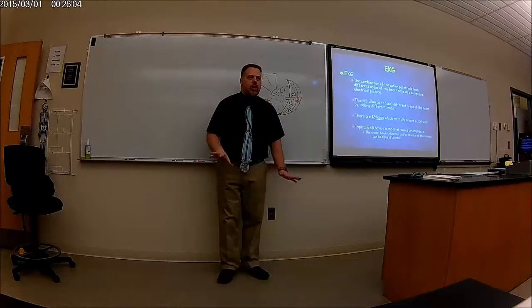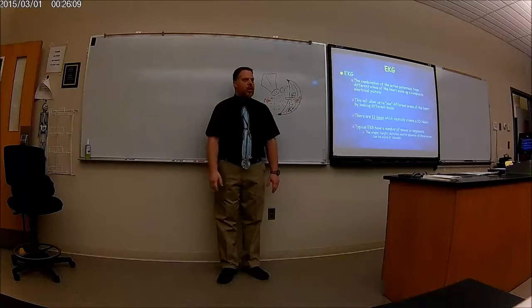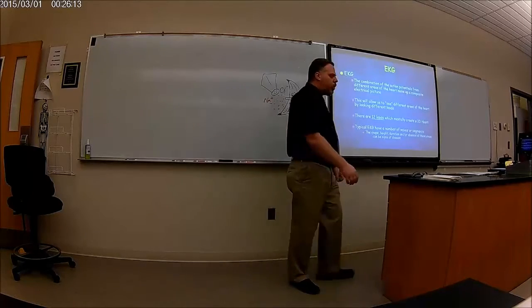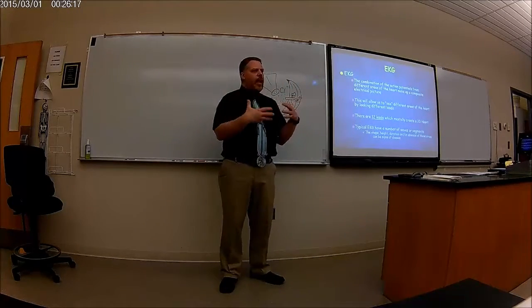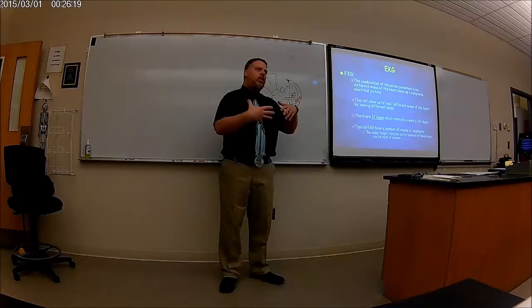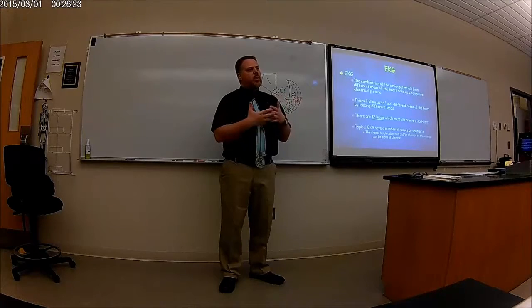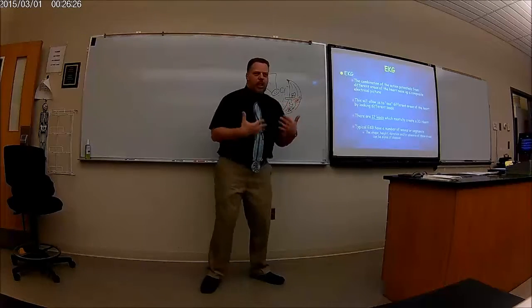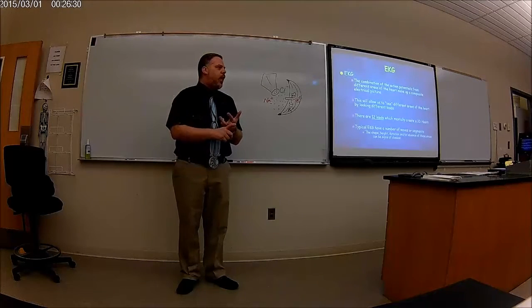I'm not going to ask you about that, but you guys are going into the health fields, you should have some idea what's going on here. Okay? So we have a total of 12 leads, and these leads will pick up the action potentials of all different aspects of the heart. But the action potentials, as you just saw, are different depending on the AV node, SA node, Purkinje fibers.